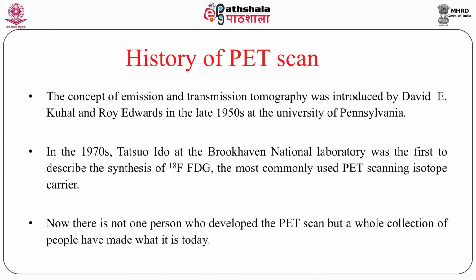Now, if we see the nuclear imaging modalities, in conventional nuclear medicine or SPECT, the isotope of choice is technetium-99m. It is a workhorse, but when we talk about cellular imaging or molecular imaging, the isotope of choice becomes fluorine-18. No doubt, there are other isotopes available like carbon-11, nitrogen-13, oxygen-15, but fluorine-18 is the choice. The reason is that most compounds can be coupled with fluorine-18, and more than 90% of examinations can be done with it.